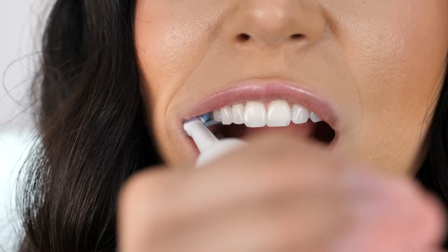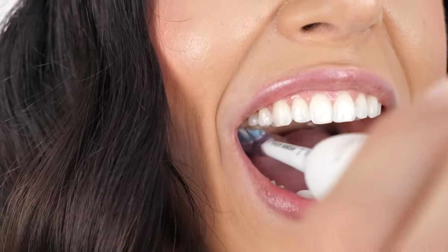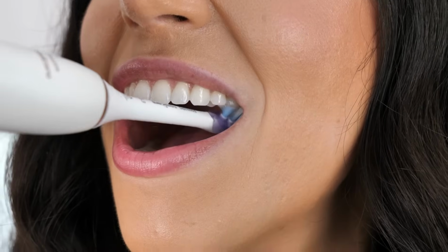I personally like to start on the top right, so I do all of the outsides of the teeth and then all of the insides and then the chewing surfaces. Again, I'm just slowly guiding the brush head from tooth to tooth, following the curve of the teeth and gums. Once it pauses, I move to the next quadrant or next section of the mouth, the top left now for me, and do the same thing all over again.